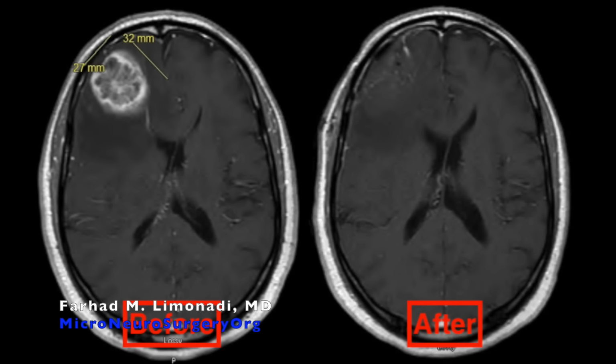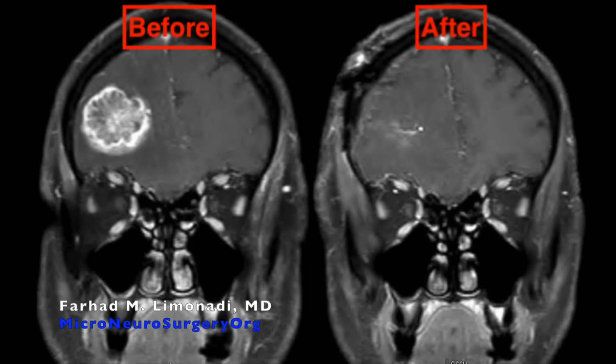Postoperative MRI scan showed complete resection of the tumor with no injury to the surrounding neurovascular structures.